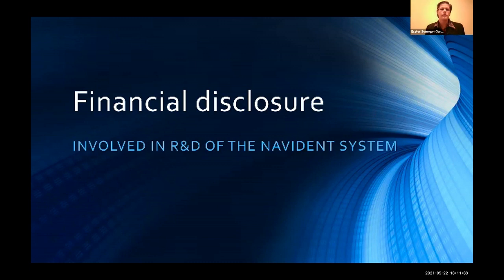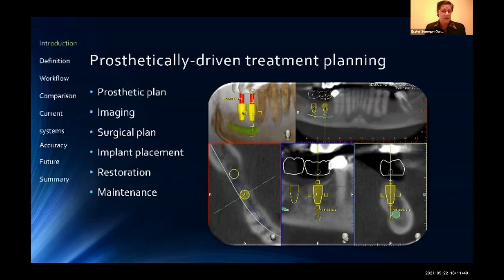talking about these. So when it comes to implant placement, I'm sure if you place implants, you're all very familiar with prosthetically driven treatment planning and how we have to follow principles to make sure that that implant is not only placed, but also becomes restorable and also functionally stable in the long term.